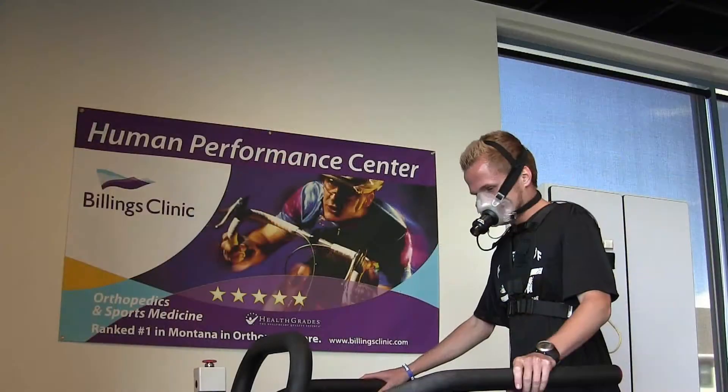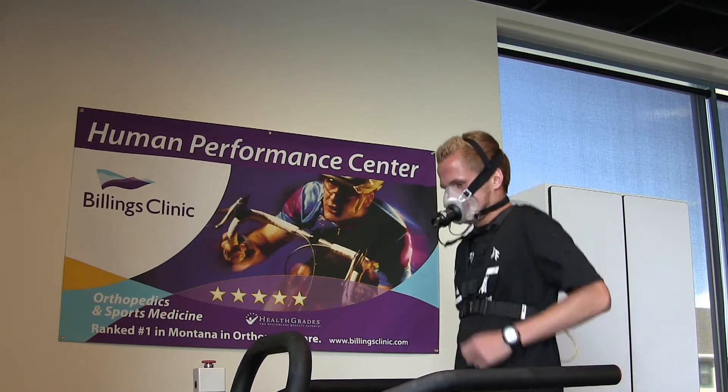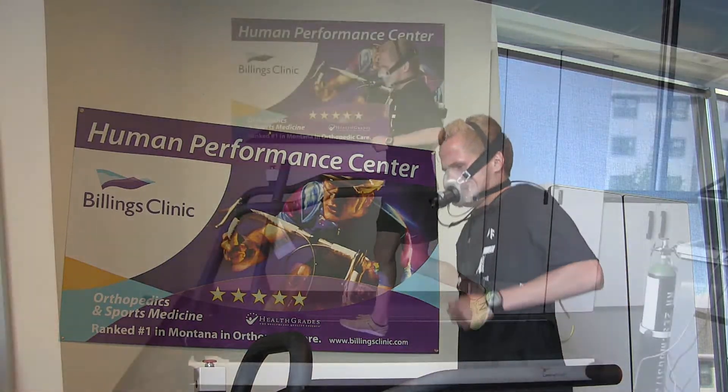My name is Becky Abrams. I'm a certified athletic trainer and certified strength and conditioning specialist here at Billings Clinic. VO2max is the body's ability to utilize oxygen, and we typically do this test on endurance athletes.